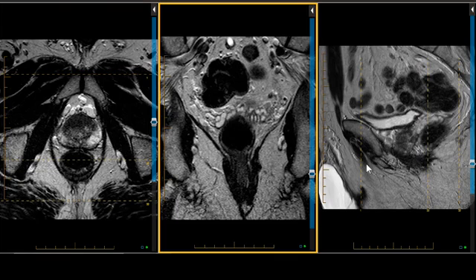So our purpose in illustrating this case is twofold. One, to illustrate the pitfalls of very far anterior cancers and how they can blend in, even on MRI, with the anterior fibromuscular stroma, and as a subset of that, be very difficult to access biopsying the gland from the back because they're so far anteriorly. The second thing I want to do is once again illustrate T staging.